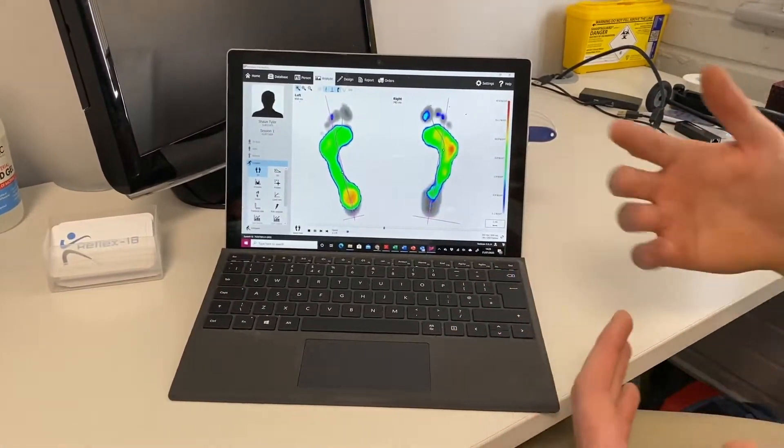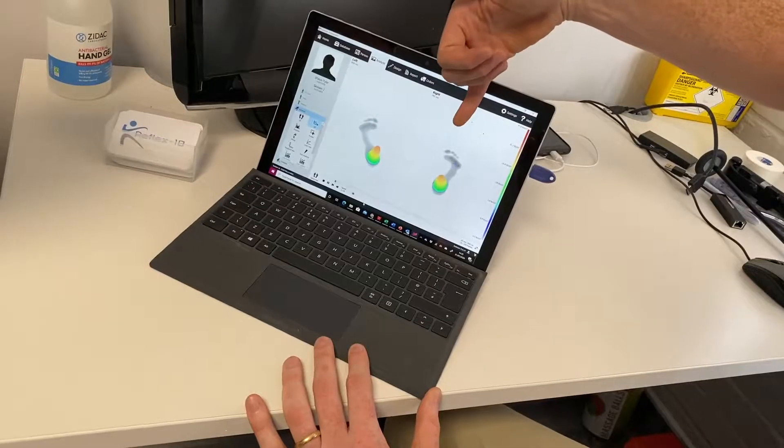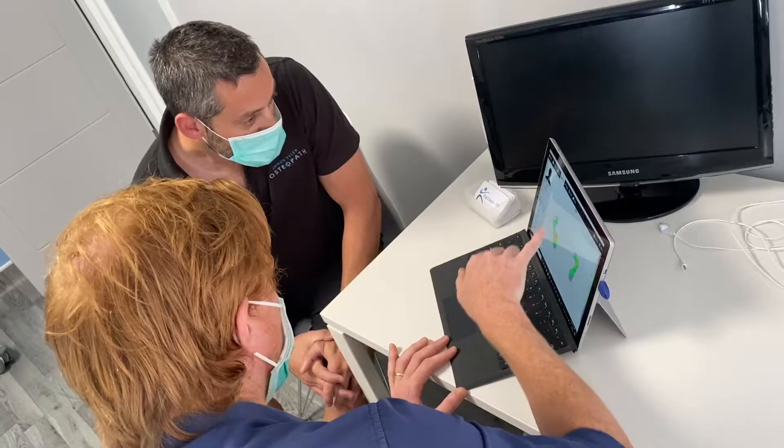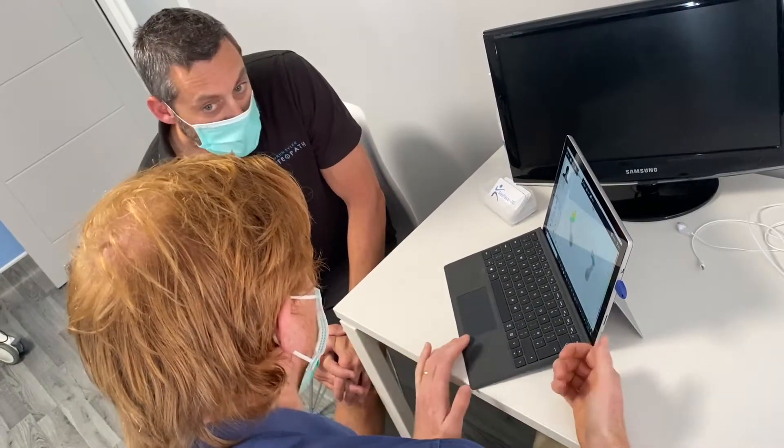This data is then processed within the computer system to give us graphical representations of the foot, which we can slow down and speed up. We will fully explain the data that is produced here, so that you have a full understanding of what it means to you.